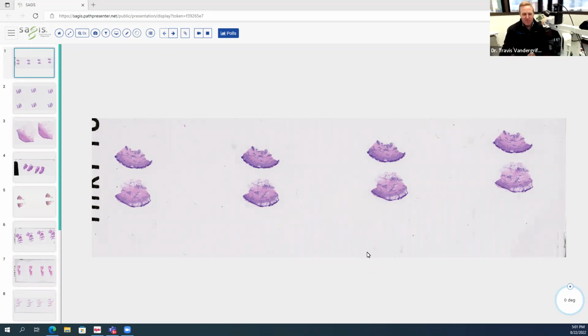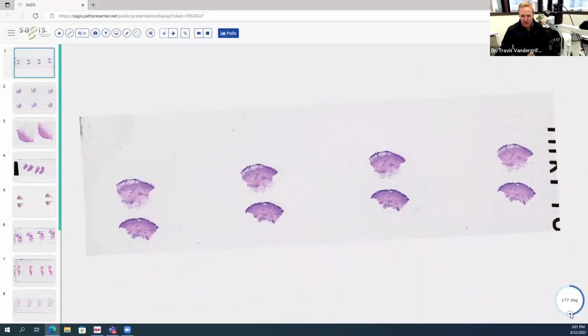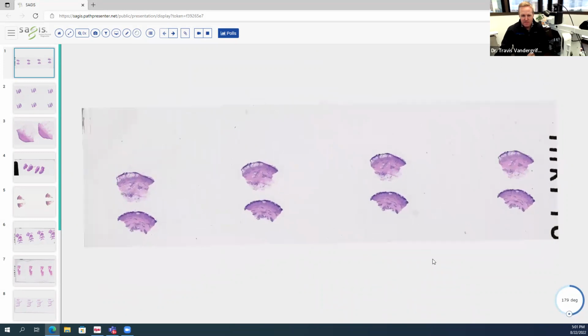Thank you for the invitation and for the introduction. I'll be going over, I think, 12 slides today that I'll be reviewing. So our first case, I'm going to spin the slide around and just make it upright here. Our first case is a punch biopsy.